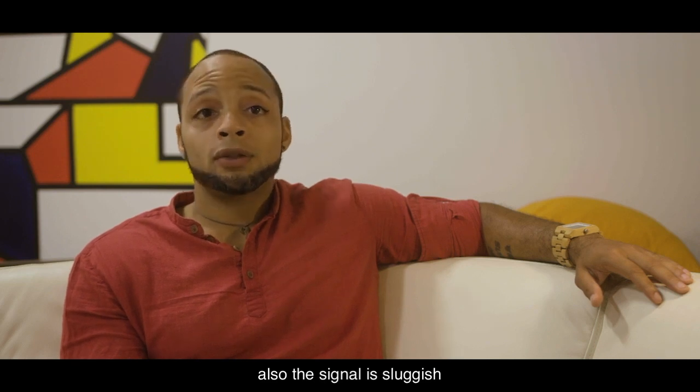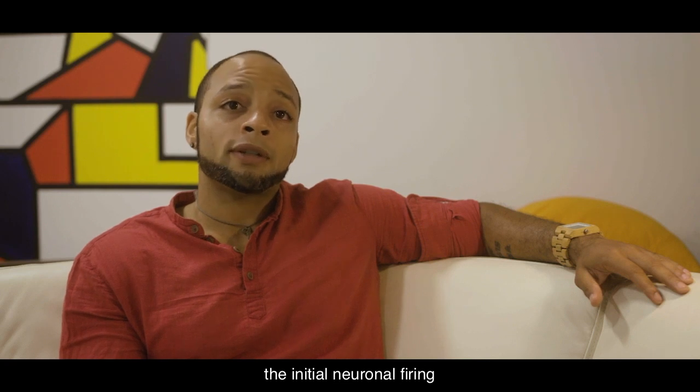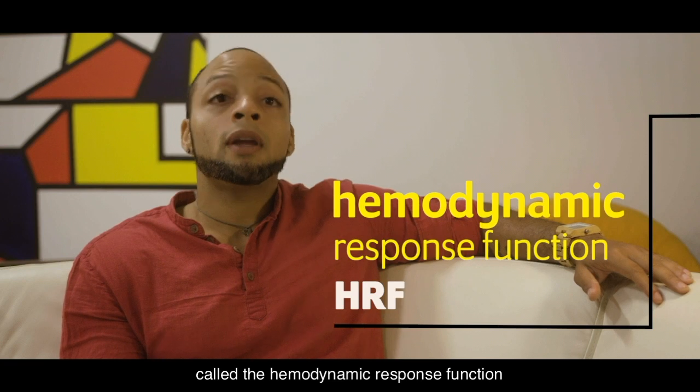Also, the signal is sluggish. It peaks at about 5 to 6 seconds after the initial neuronal firing. This time course is sometimes called the hemodynamic response function, HRF.